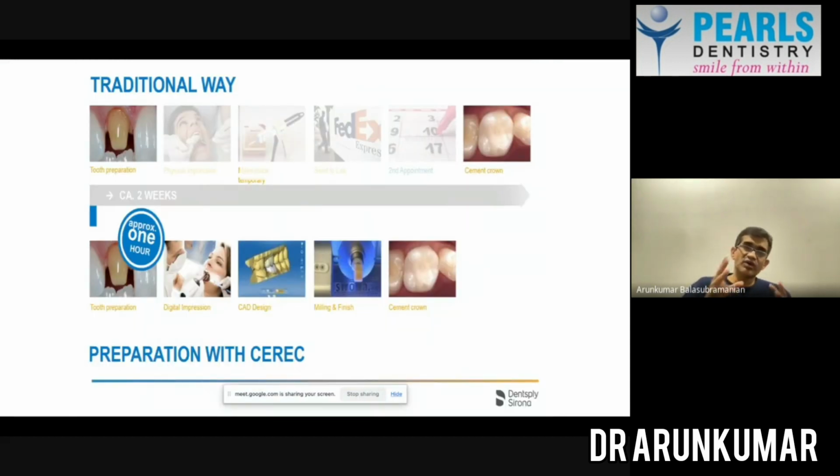So when compared to the traditional way, where the tooth is prepared, measurement is made, it goes to the lab, and then there is another appointment, which typically happens after a week's time, and then the crown is cemented.